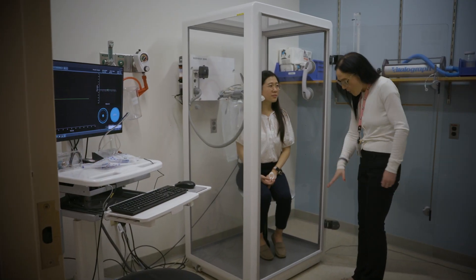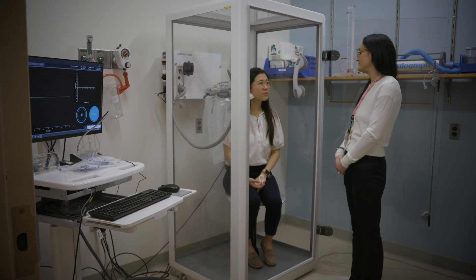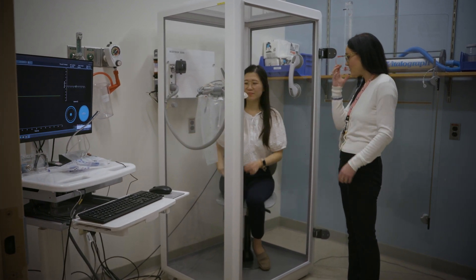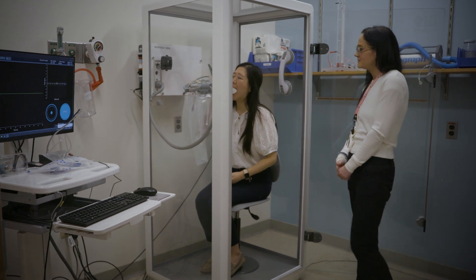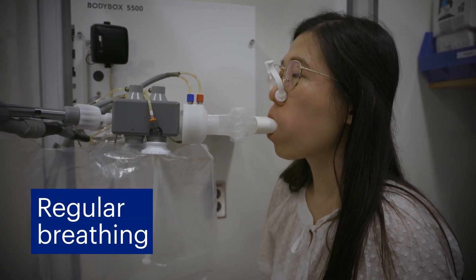The first test performed is called a spirometry test. This test looks at your ability to breathe in and quickly force out all of the air out of your lungs. You will start with normal breathing.